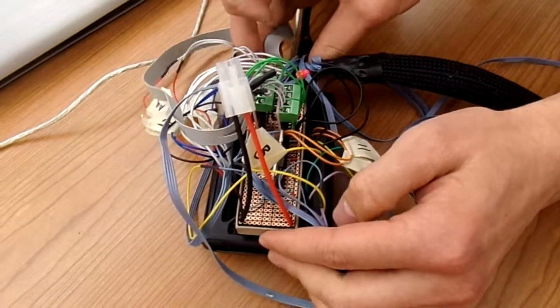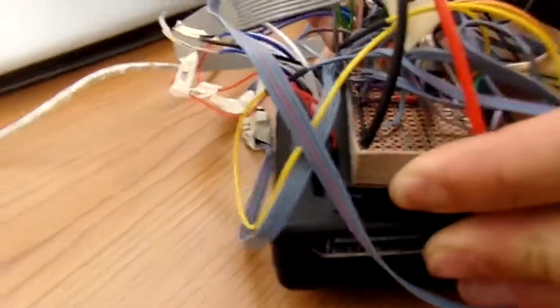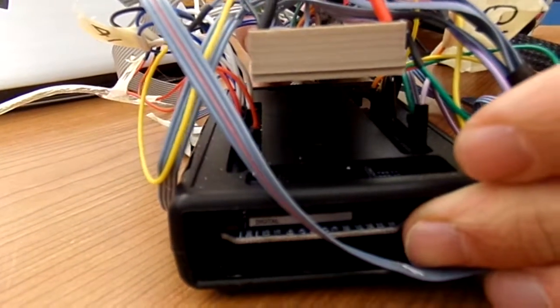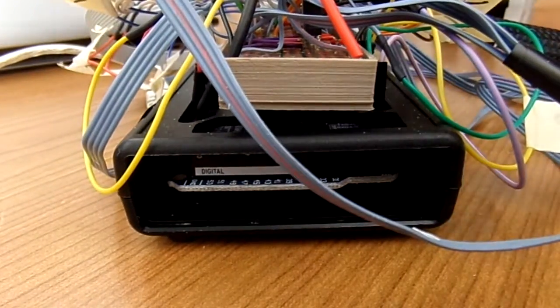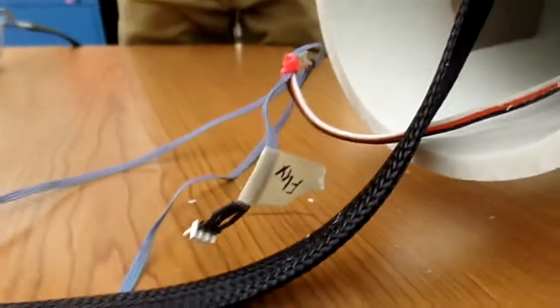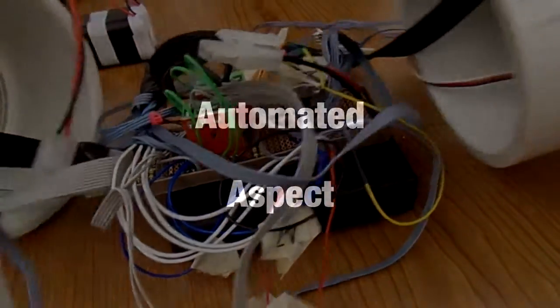This is housed in a PLA box which velcros down to the top of our Arduino housing. This allows it to rest in the middle when all the other wires run over the sides and into the slots. This entire apparatus can then slide right into the back of our wrist housing, and everything will come together like so.